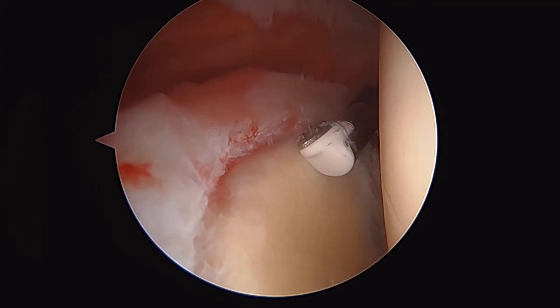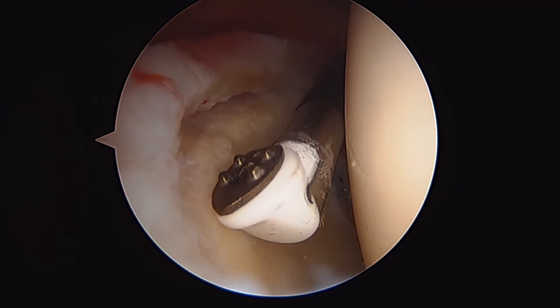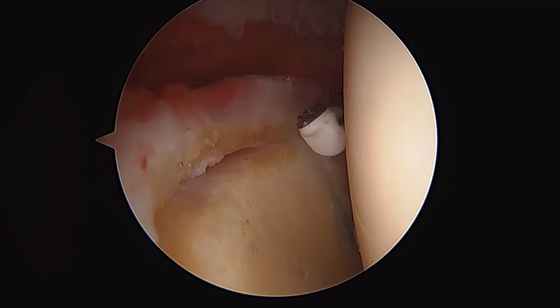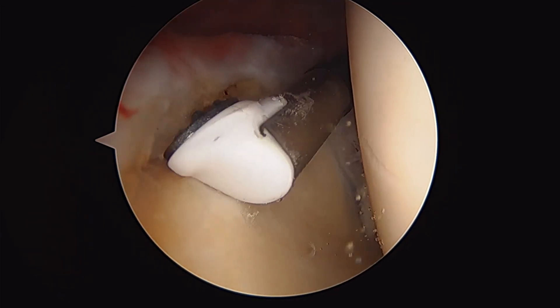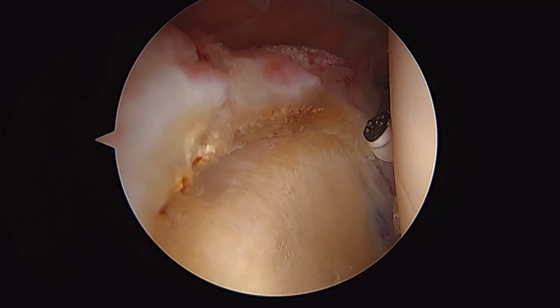This is our radiofrequency ablator, and this just fires a current into these frayed edges just to touch it up and round it off and make sure there's no edge that might propagate or cause him any sort of pain. And that's the gold standard treatment for a SLAP tear. That looks good.